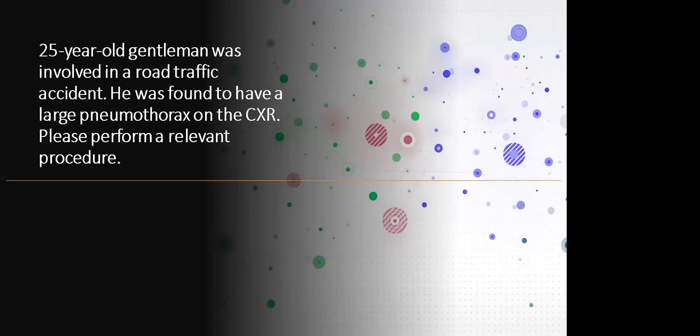Okay. I'm preparing the equipment and draping the patient and giving the local anesthesia of lidocaine at the mid-axillary line at the 5th intercostal space.